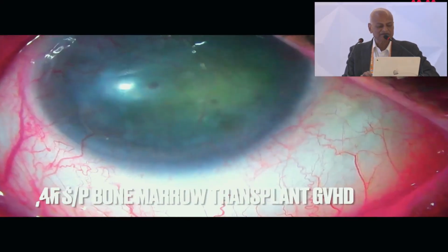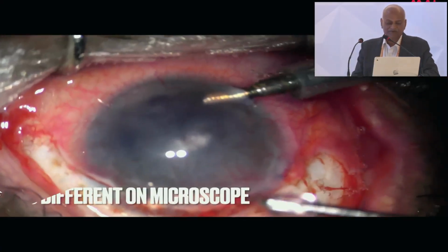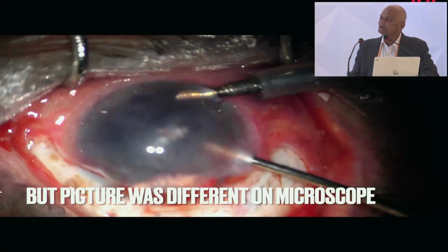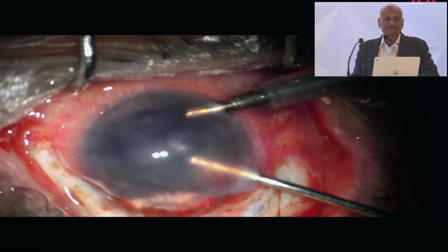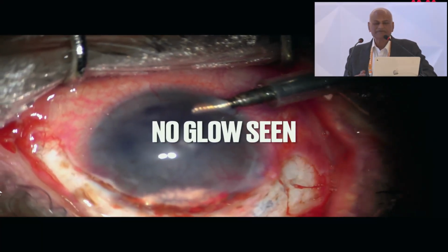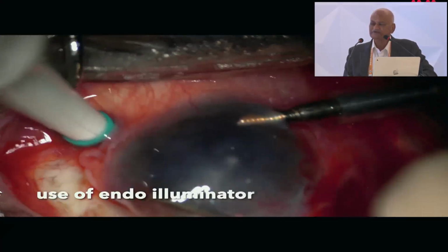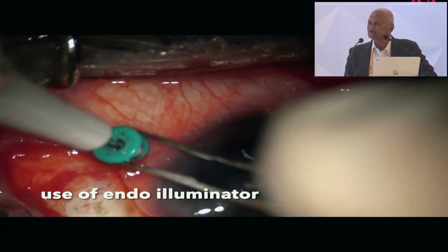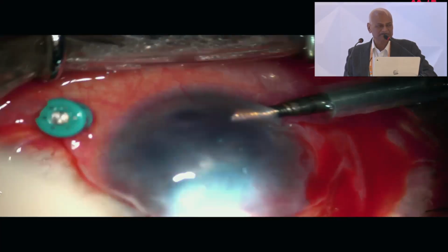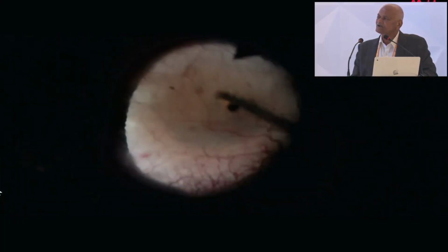Then you will see, this is a 45 year old patient, where you will see the corneal opacity and vascularization; you can't see the glow. So in such a situation, if there is no glow, then how are you going to operate? Here, what we can do is use the endo illuminator. With this endo illuminator, you can see the glow now.